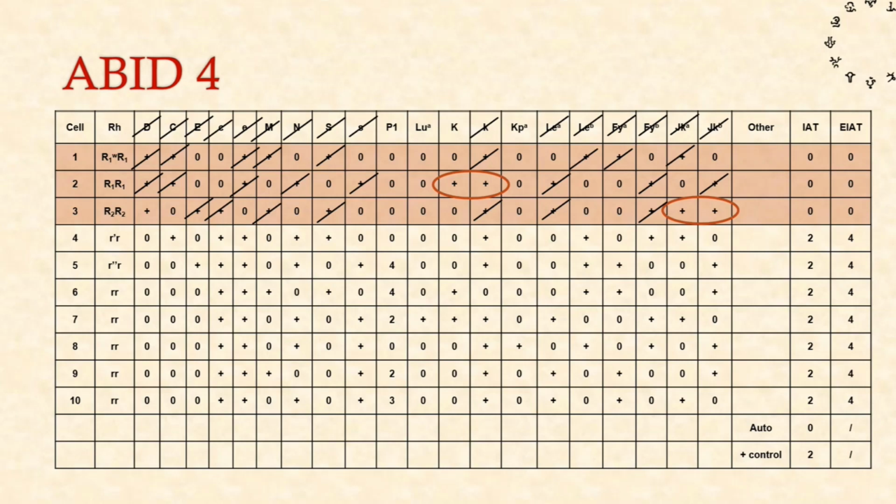Then if you go through and do your exclusions, you want to see what you can get rid of. Great, we can get rid of JKB on that second line, but we can't actually get rid of it on the third line because that is heterozygote. You can't use that one. But you've got your one exclusion following your BSHI guidelines. So if you did want to exclude that, feel free to go ahead and do so.